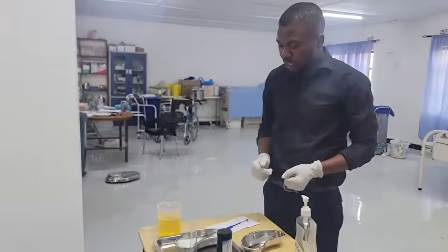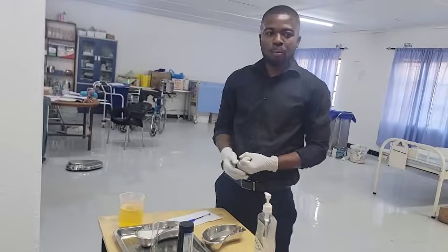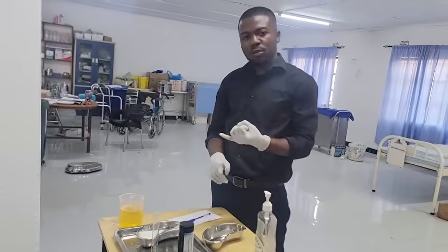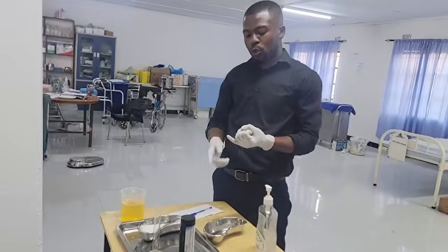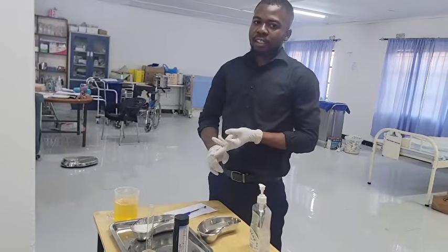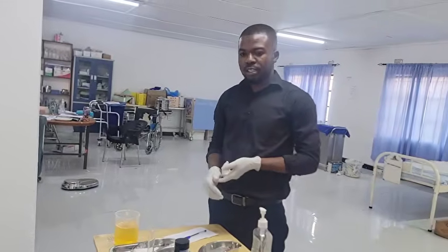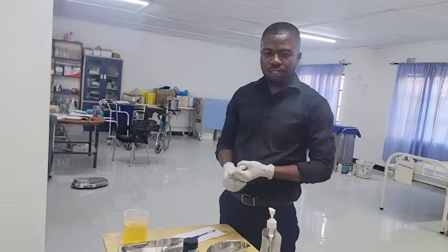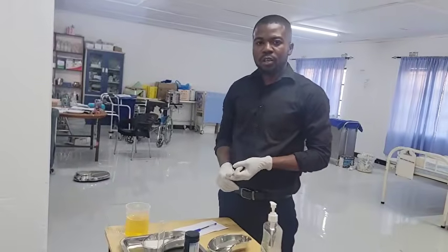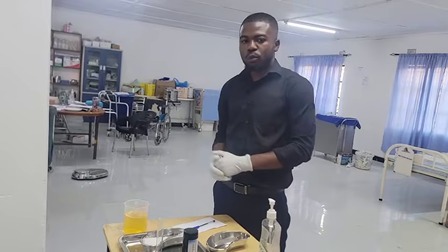So after donning gloves, you start with the physical properties. For the physical properties, you are looking at the amount of urine. You are also looking at the smell, the color of urine, and the contents of urine. What I mean by the contents is you need to check: is there blood in urine? Is there pus in urine? Or are there particles in the urine? Yes, so you have to check.